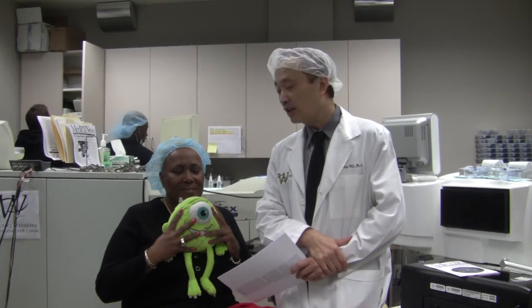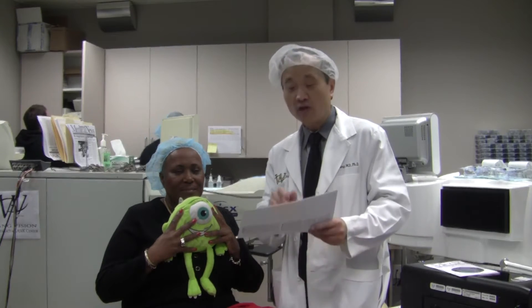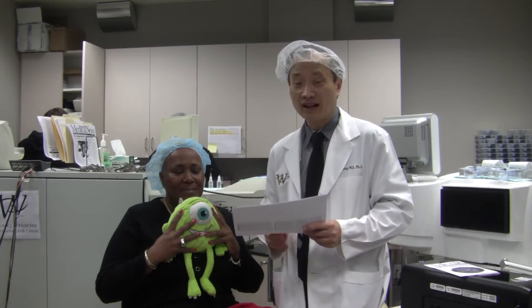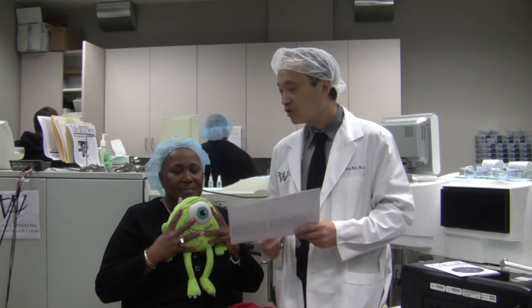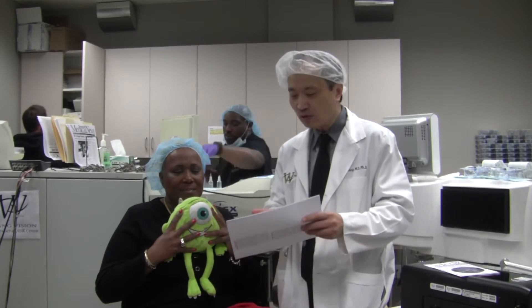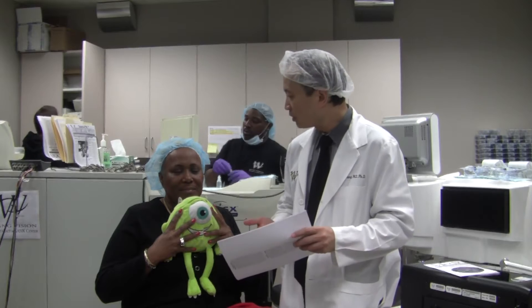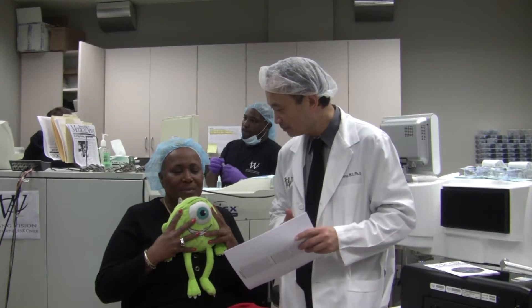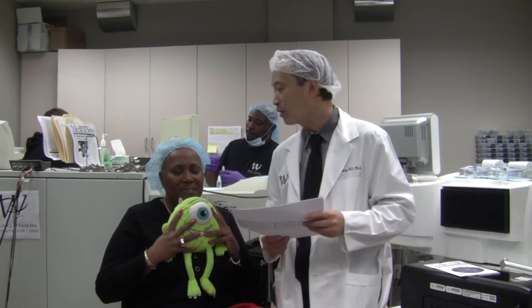I promised her before 3D LASIK today — we'll give her something to read without reading glasses. Not just 10 minutes, but before your 3D LASIK, if I give you something to read like this without reading glasses, you could not really read, right? Right.